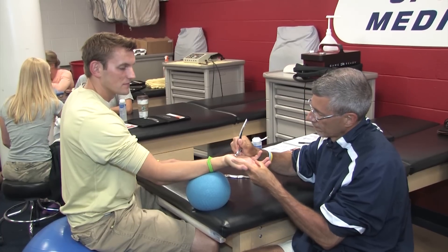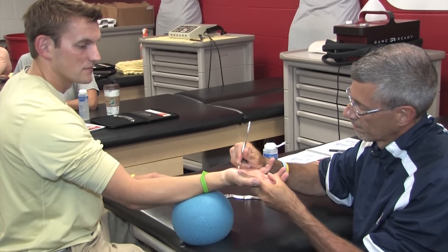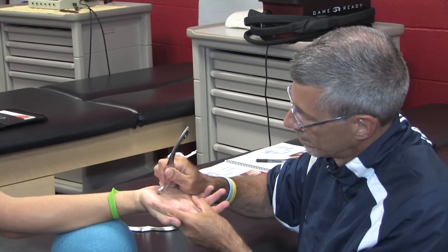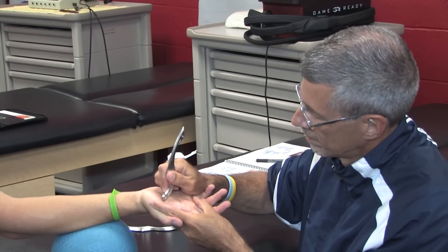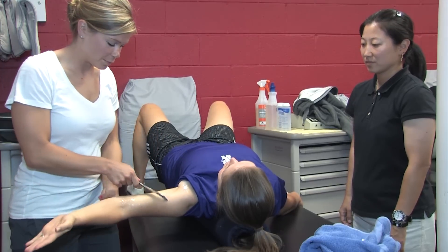Working on the thenar eminence. He can contract, curl a little bit, extend a little bit, go back and forth. You are already doing a combination of scooping and sweeping — active range of motion and application of the instruments.